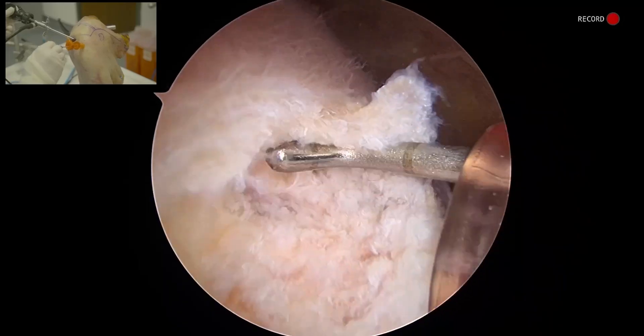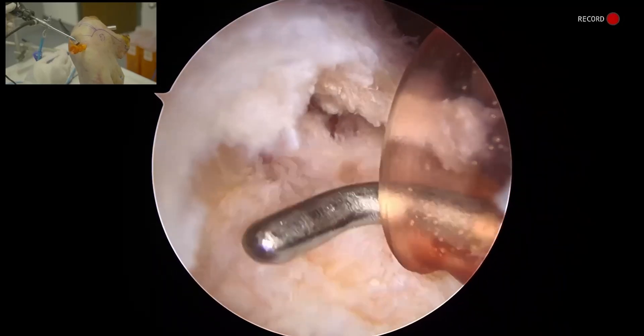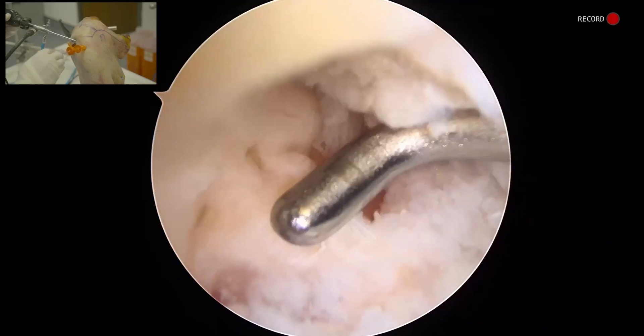Here you can really see this rotator cuff tear at the supraspinatus insertion. If we peek underneath this veil, you can see the articular surface. So we're right here at the articular margin.